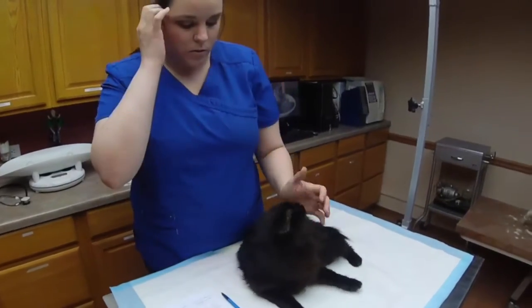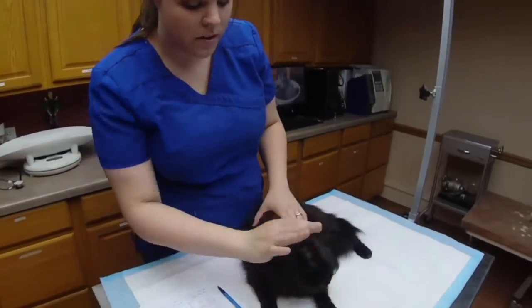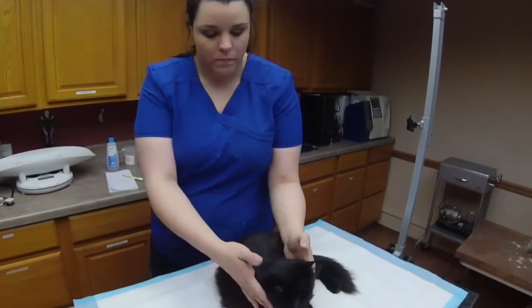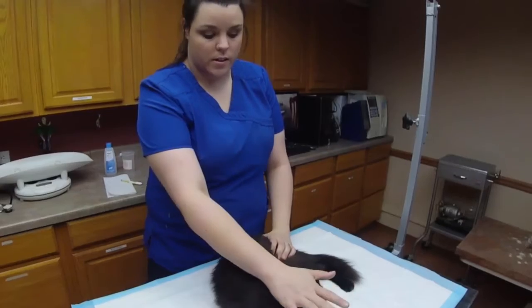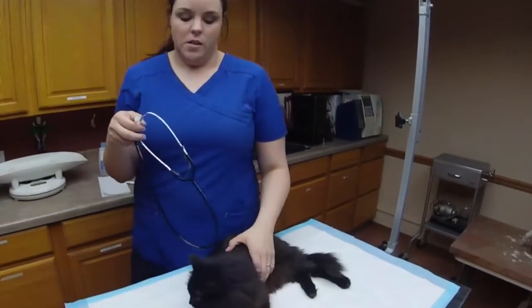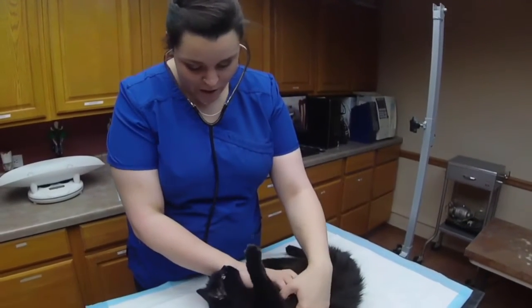We'll now listen to her heart. It is obvious that she does have some kind of wheezing going on. That was gross. That's why I picked her, so that we could probably get her started on medication and run the necessary blood work that we're going to need to do. So we're going to start on her left side. You're so good.